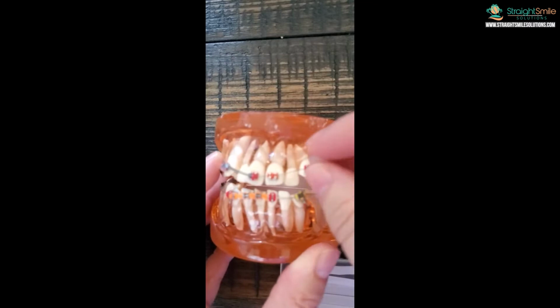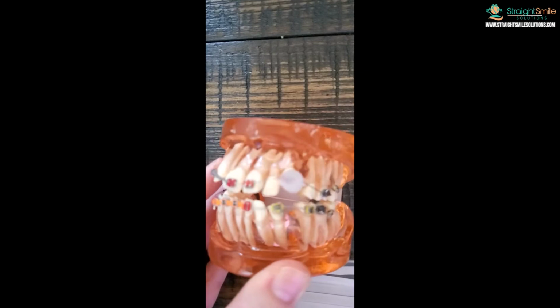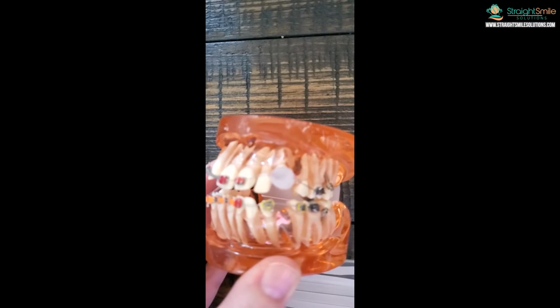So let's say this hook is bothering you. Just press it on. It's okay. It's fine. It's just beeswax. You can leave it on while you eat, leave it on while you sleep. But every time you brush your teeth, you should pick off all the old wax because there's going to be plaque underneath it. Brush your teeth and put fresh pieces on. So at least twice a day, you're pulling all the old wax off and putting all new wax on. Okay, that's really, really important.